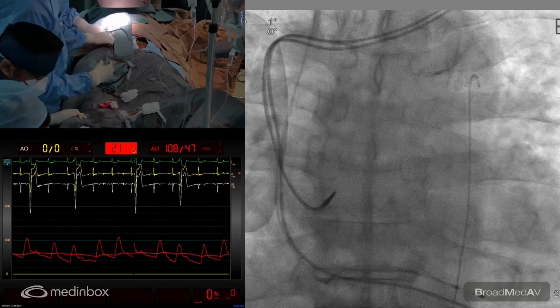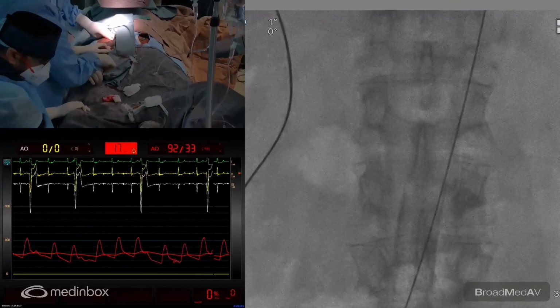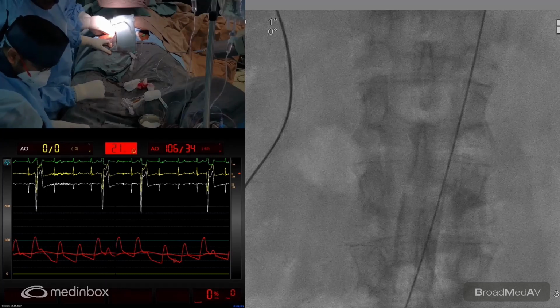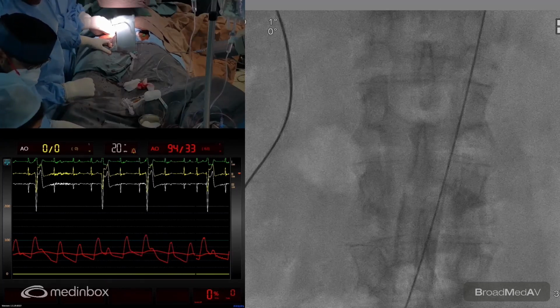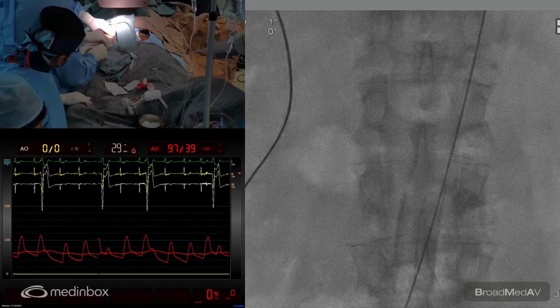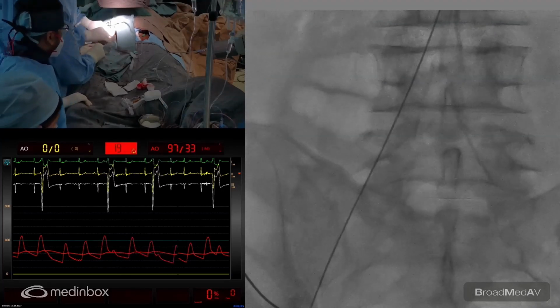So as you know, we need to be very careful in the groin. And we're going to go sequentially up with a 9 and then a sequential dilator, which will get up to 14 French. As you know, the sheath is 14 French. Can we get the Python ready? Yes. Keep it on the table, please. So watch the groin as we go up.